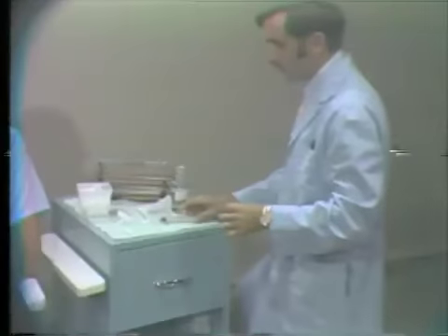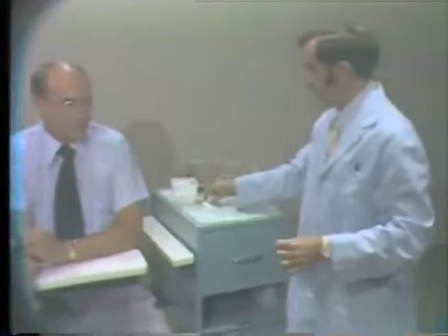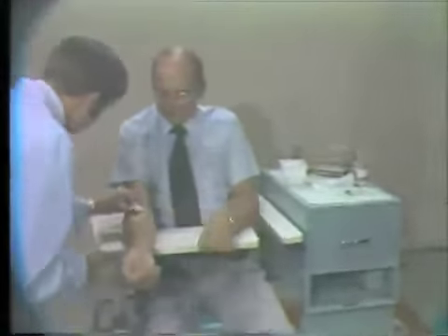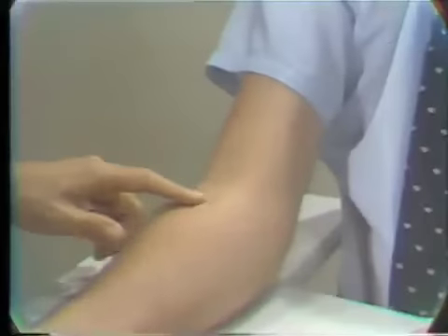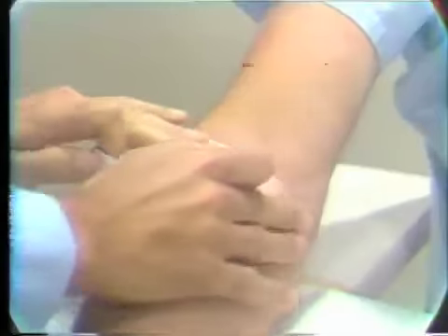After having distributed the blood, then we'll come back to our patient and see how the patient is doing. You'll notice that the coagulation mechanism is working fine. There is no bleeding in the area. There's no need for a pressure bandage. Bandage is applied as any other bandage would be. And we're all set with the syringe drawing technique.